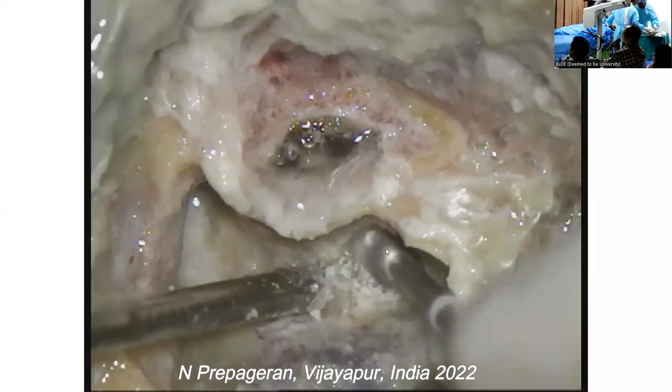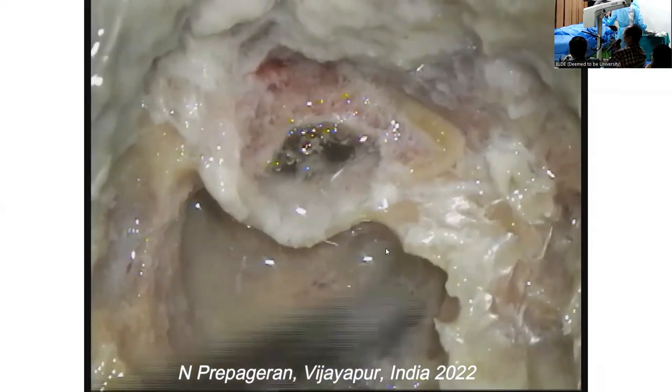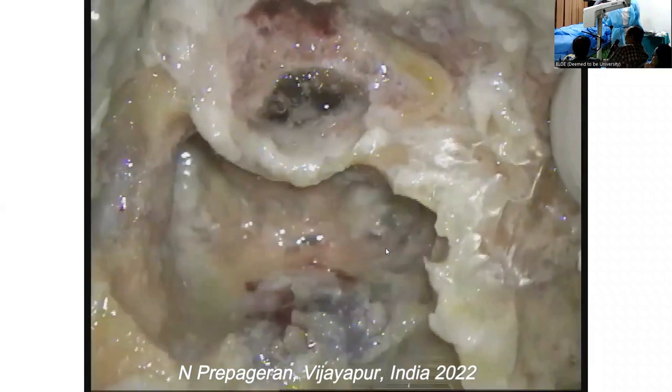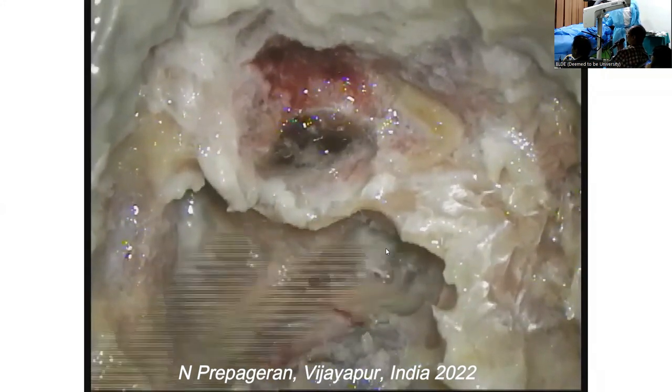Guys, I like the way this drill is kicking back. It's like an old motorbike, you know? Doop, doop, doop. Fine. Every time it's kicking back. You have bony blood, no? Guys, can you see the blue here? The jugular bulb. Yes, sir.